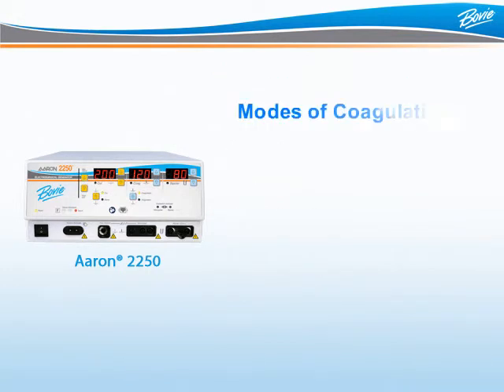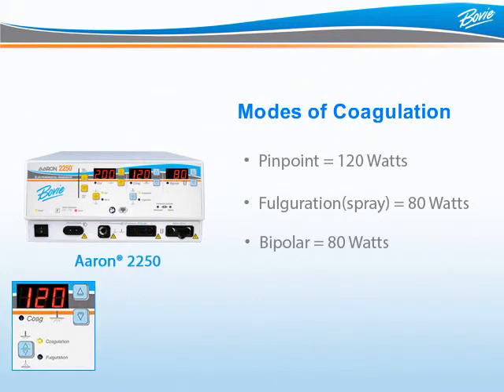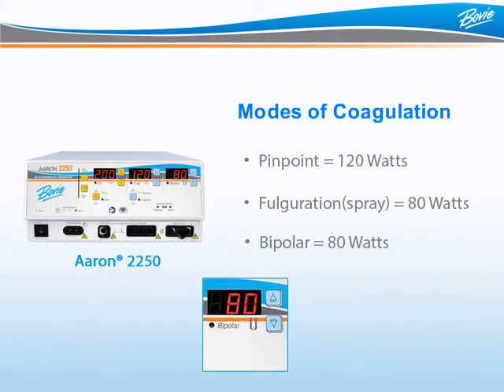Just like the ARIN 950 and ARIN 1250, the ARIN 2250 offers three modes of coagulation: pinpoint coagulation up to 120 watts, fulguration or spray up to 80 watts, and bipolar coagulation up to 80 watts. To use the pinpoint or fulguration modalities, press the blue double triangle button until the proper LED is illuminated. To utilize bipolar, simply adjust to the proper power setting in the bipolar display and activate.